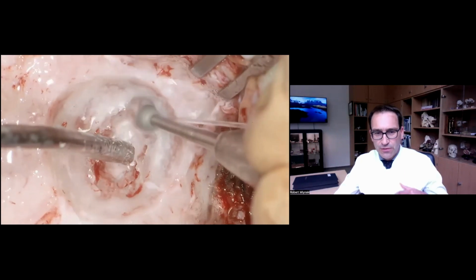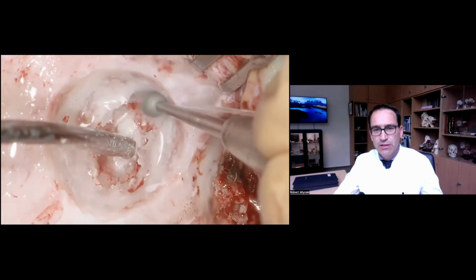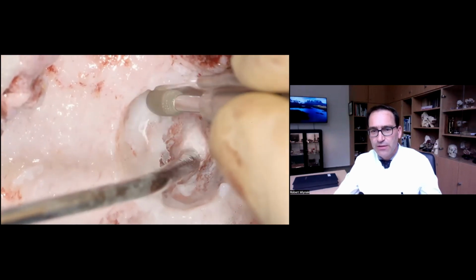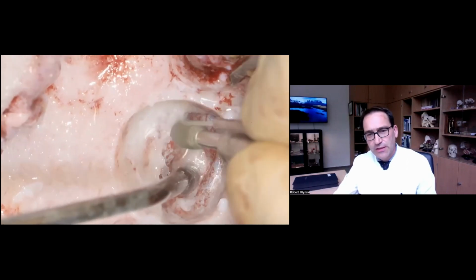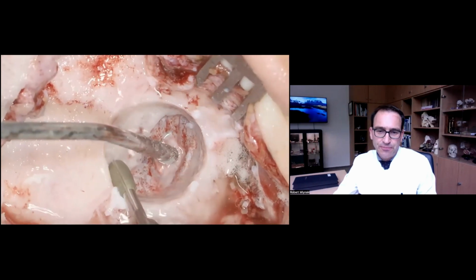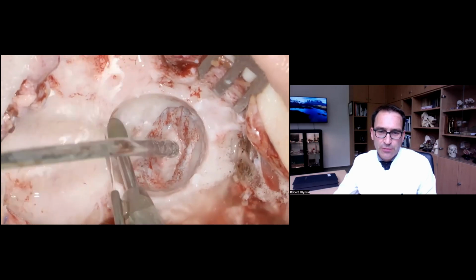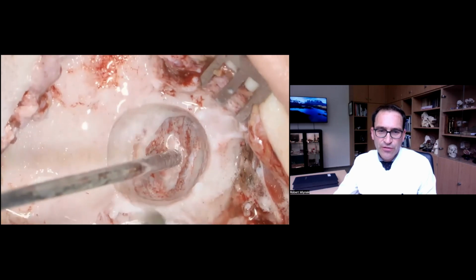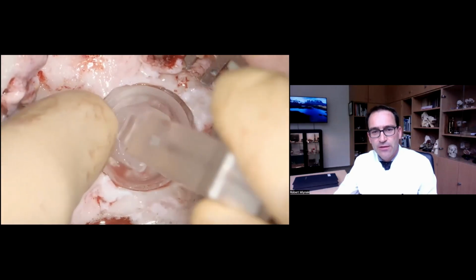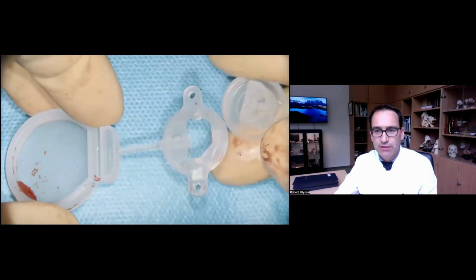And now we lift or impress the dura from the skull, and we can now, with the diamond, drill the tabula interna of the bone. Later, the dura can flip back to the skull, and we can place our implant. We are using a diamond burr when preparing close to the dura. Continuous irrigation, high-speed drill, 40,000 rotations per minute, and in between we always use the sizer and the dummy for the implant.